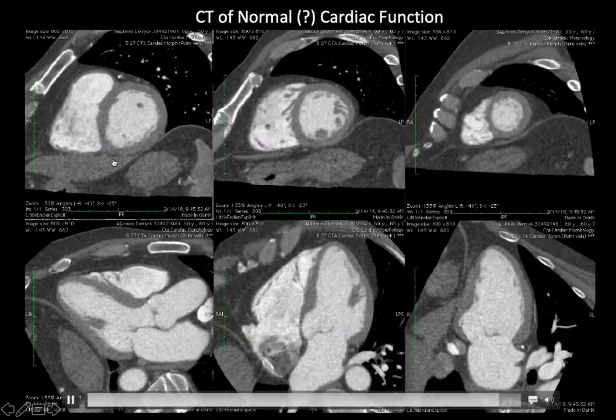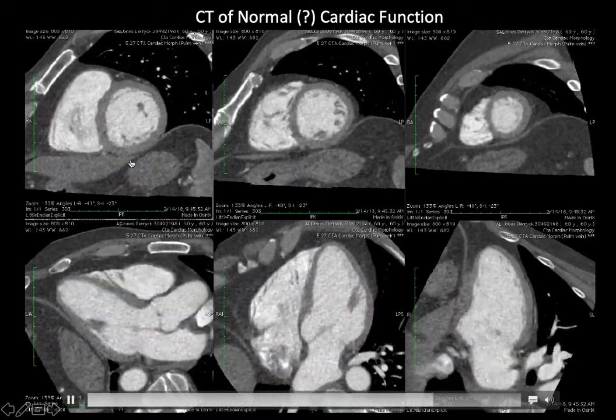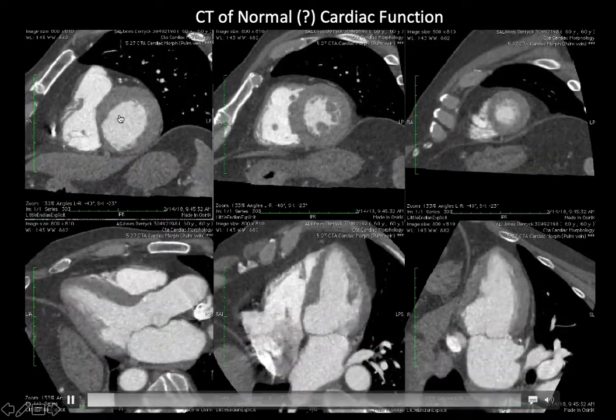So that kind of gives you an indication that this is probably not just the fact that you're getting into the valve that is less contractile. This is actually kind of a dysfunctional piece of myocardium. So if you can see it here, at some point this kind of goes away and the aorta will come out this way.